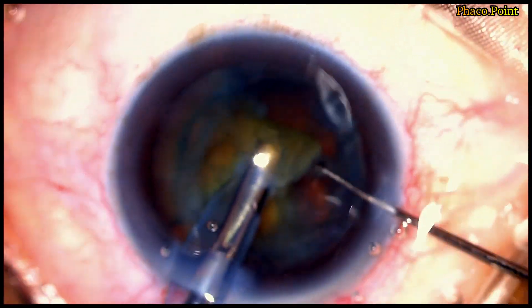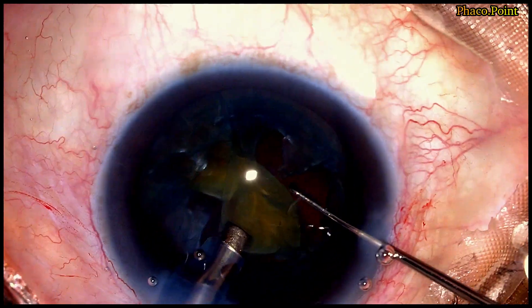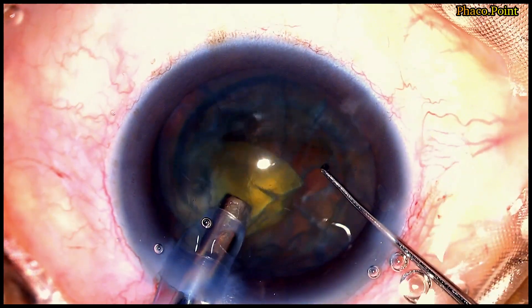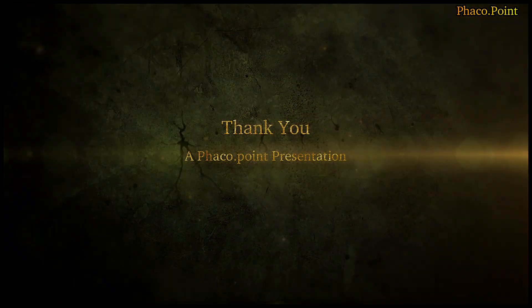Having used it now for quite a few cases, I believe that the Mohanta pre-chopper has an important role in the downsizing of soft cataracts. Pre-chopping a soft cataract takes away the struggle which we often face while trying to chop and downsize a soft cataract. This brings us to the end of the nucleus management in this case and towards the end of this video tutorial, which I most sincerely hope you found useful. Thank you.